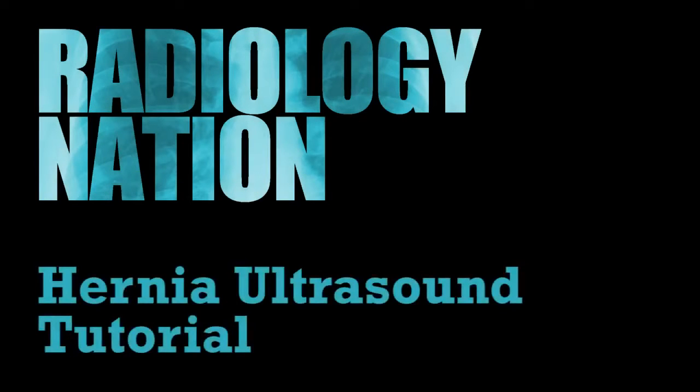Welcome to this Radiology Nation tutorial video where we will be demonstrating a technique for ultrasound assessment of inguinal and femoral hernias. In this video we will explain a logical, stepwise approach to hernia ultrasound whilst refreshing key anatomical landmarks and showing some examples of common pathology.